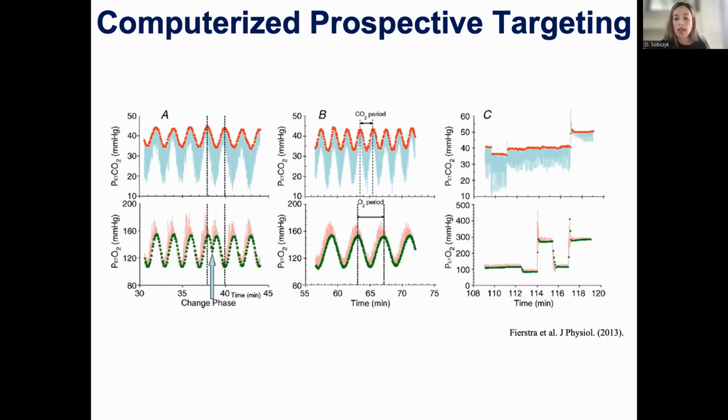Lastly, on targeting, end-tidal CO2 and O2 are independent of changes in ventilation. So a person starts breathing harder due to the increase in CO2, and the system is able to compensate and keep them at the desired targets.